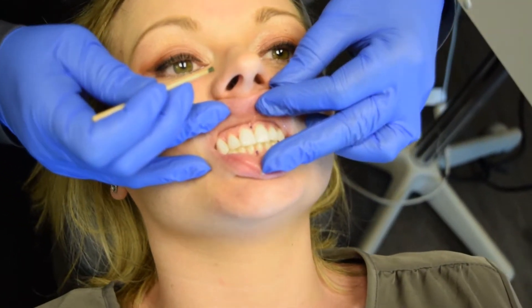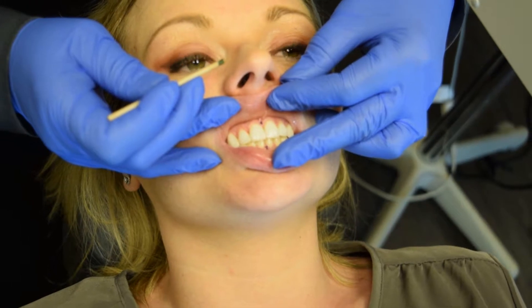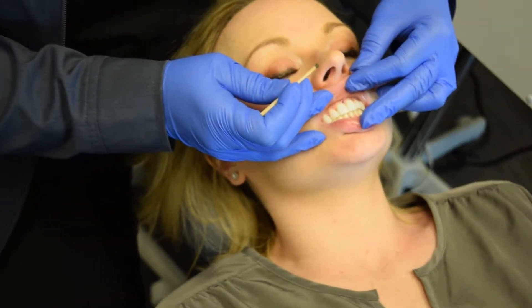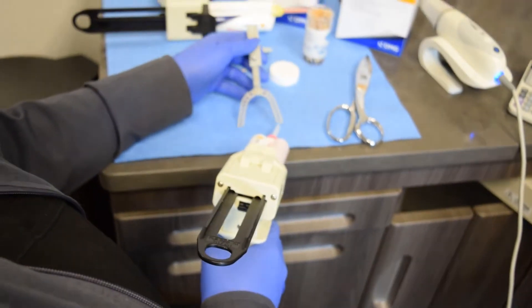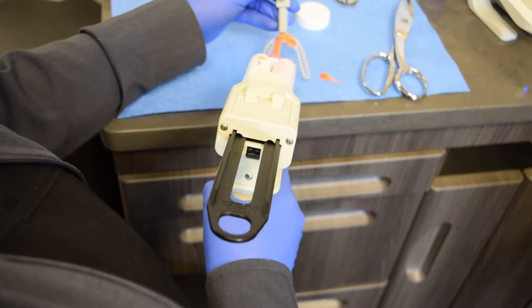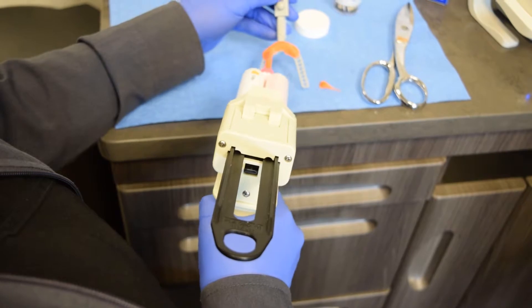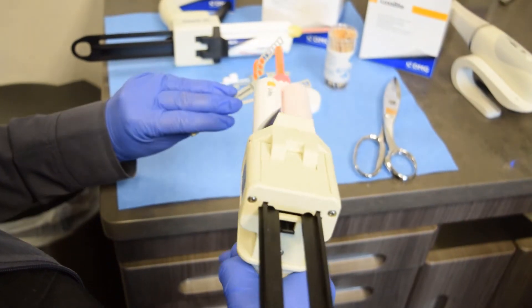So if you're doing a digital bite, typically using a George gauge is probably one of the more popular ways. There are many methods to taking a bite for your dental sleep apnea appliance, but using the George gauge and the obite, you can put a little bit around the anterior and a little bit on the second molars to make more of a tripod.